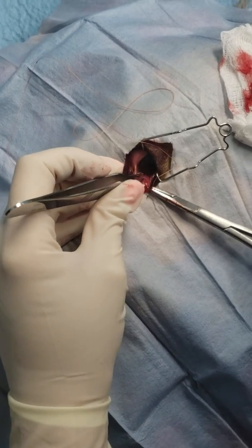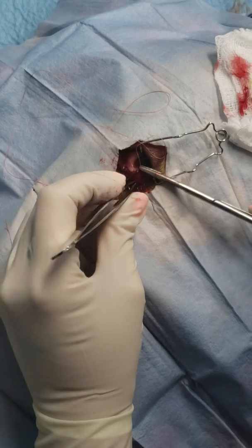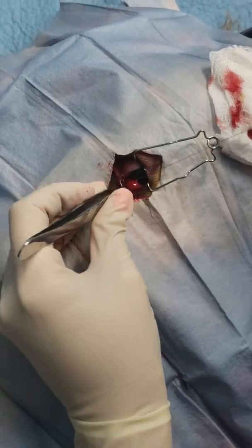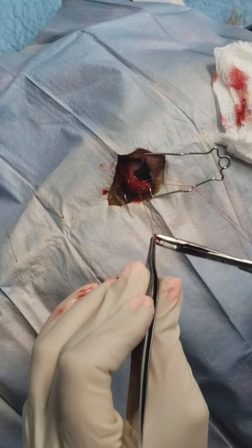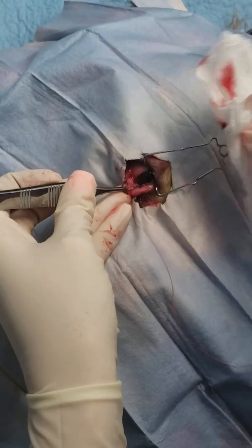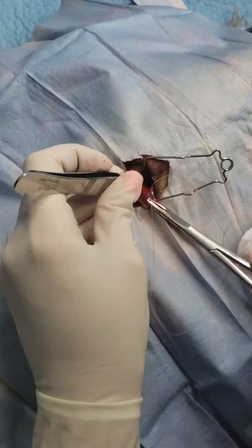Now we're just going to run down our whole pocket — the length of our pocket — with a simple continuous suture. As you start creating your pocket, the prolapsed gland is going to tuck right in on its own.